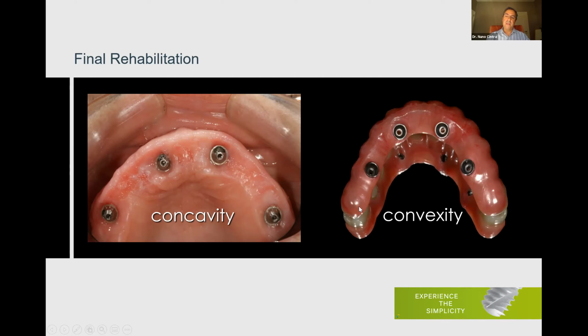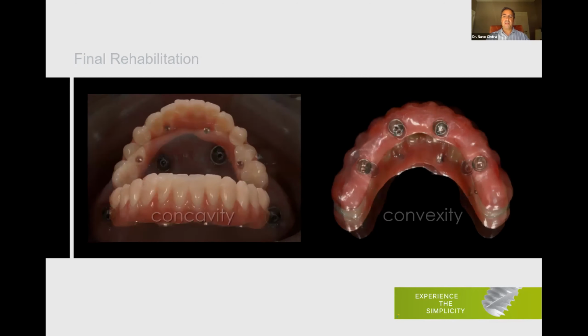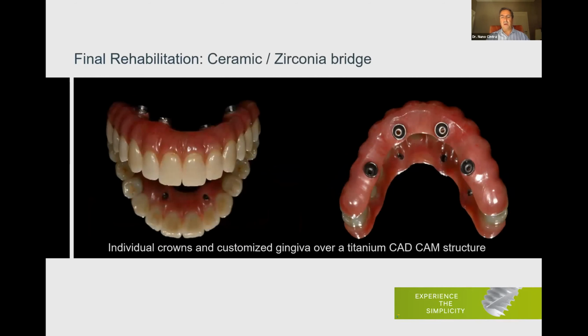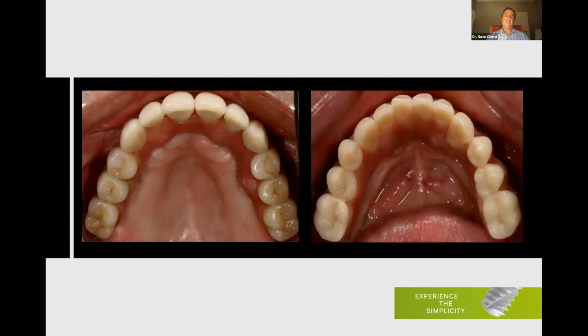We don't want wings. We don't want acrylic extensions. Nothing of that. We want this to fit perfectly. No space between. Okay, that's the best way. That's the best solution for the final rehabilitation. And the final rehabilitation can be an acrylic bridge that works very well, or can be a ceramic or zirconia bridge, something like this that we can deliver above 4 implants or 6 implants.